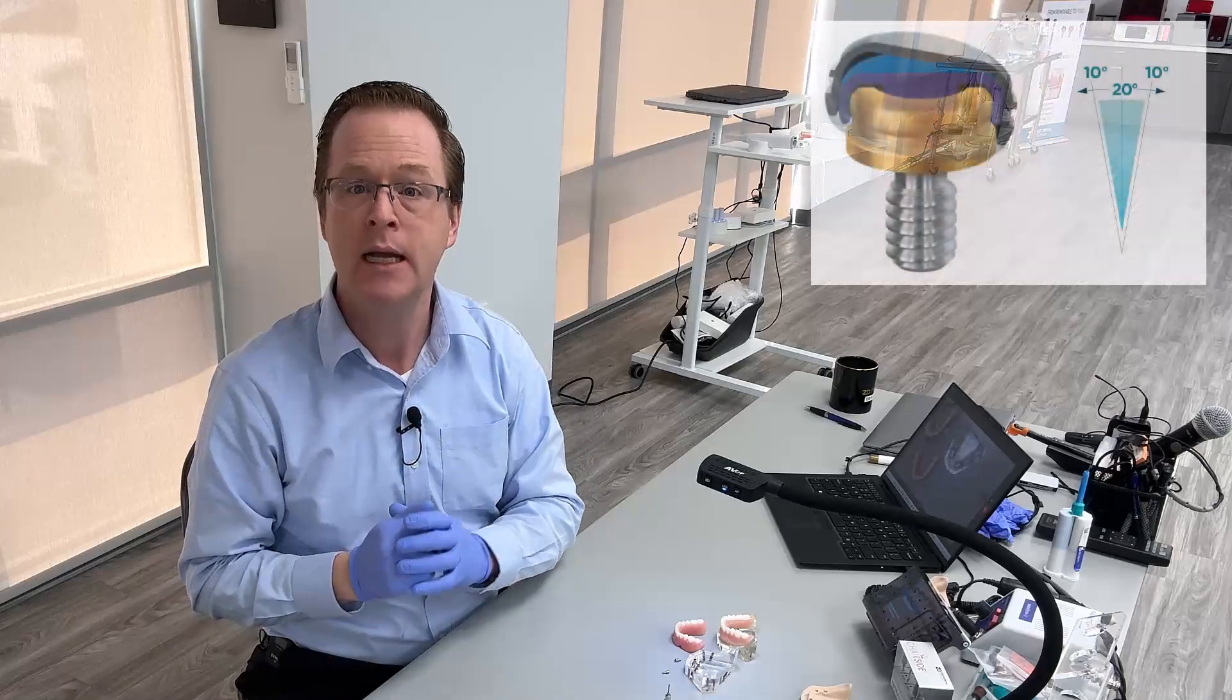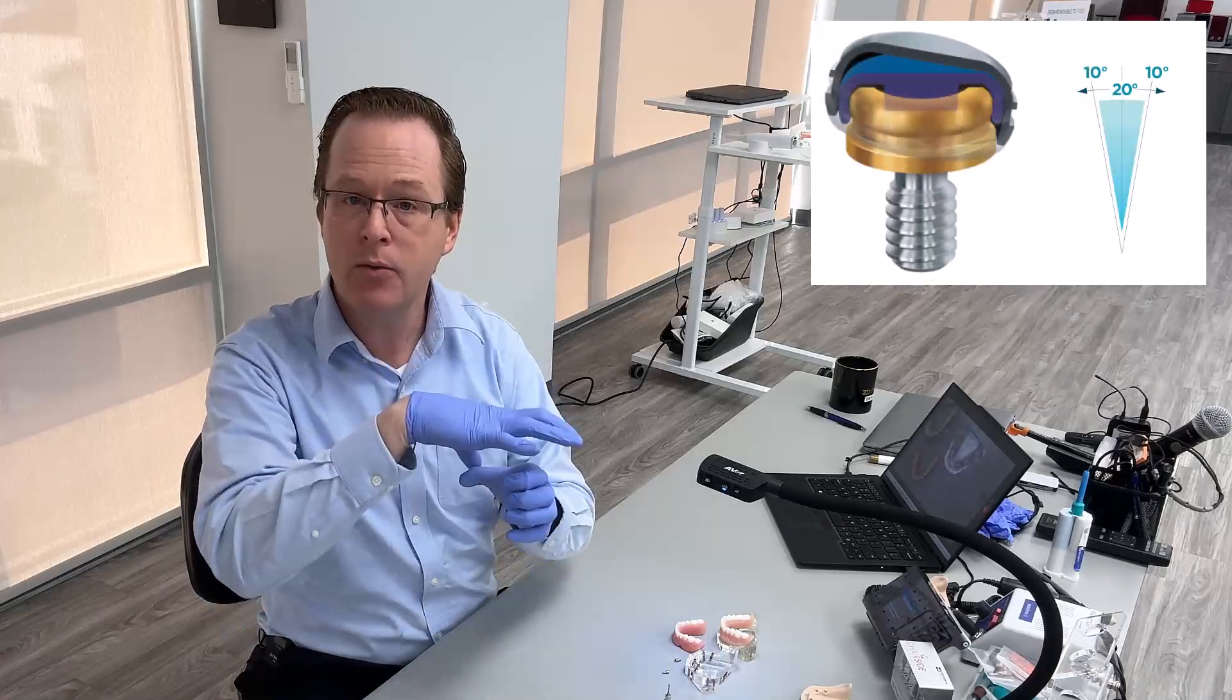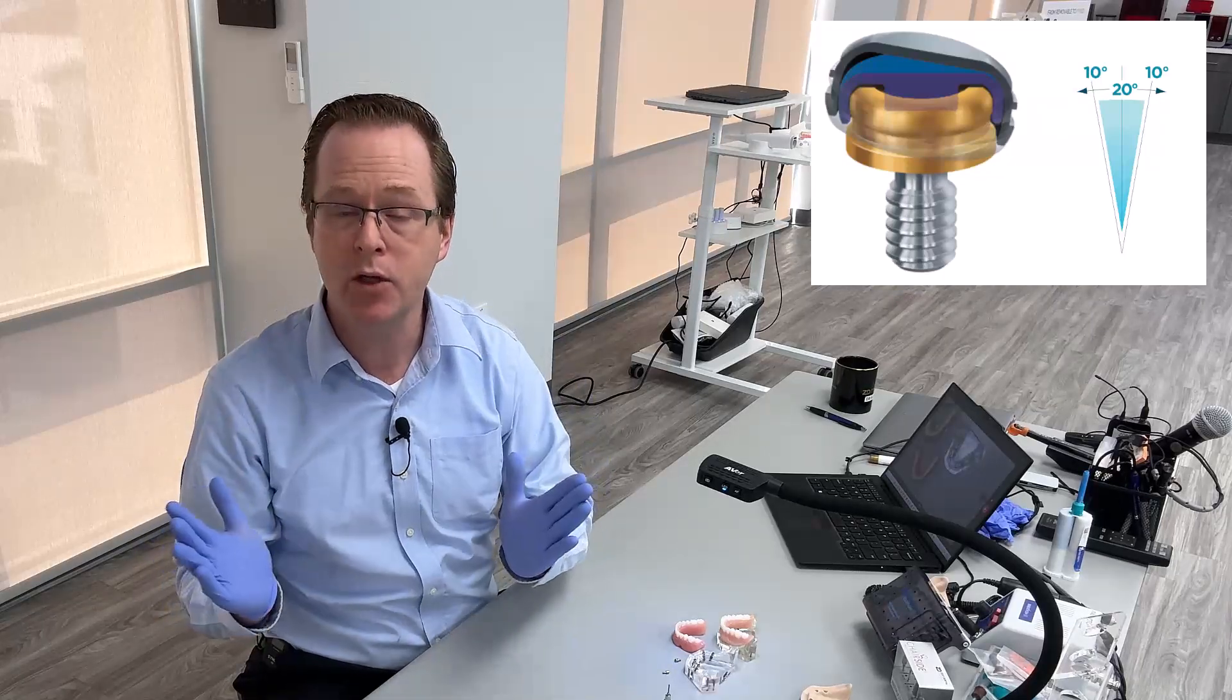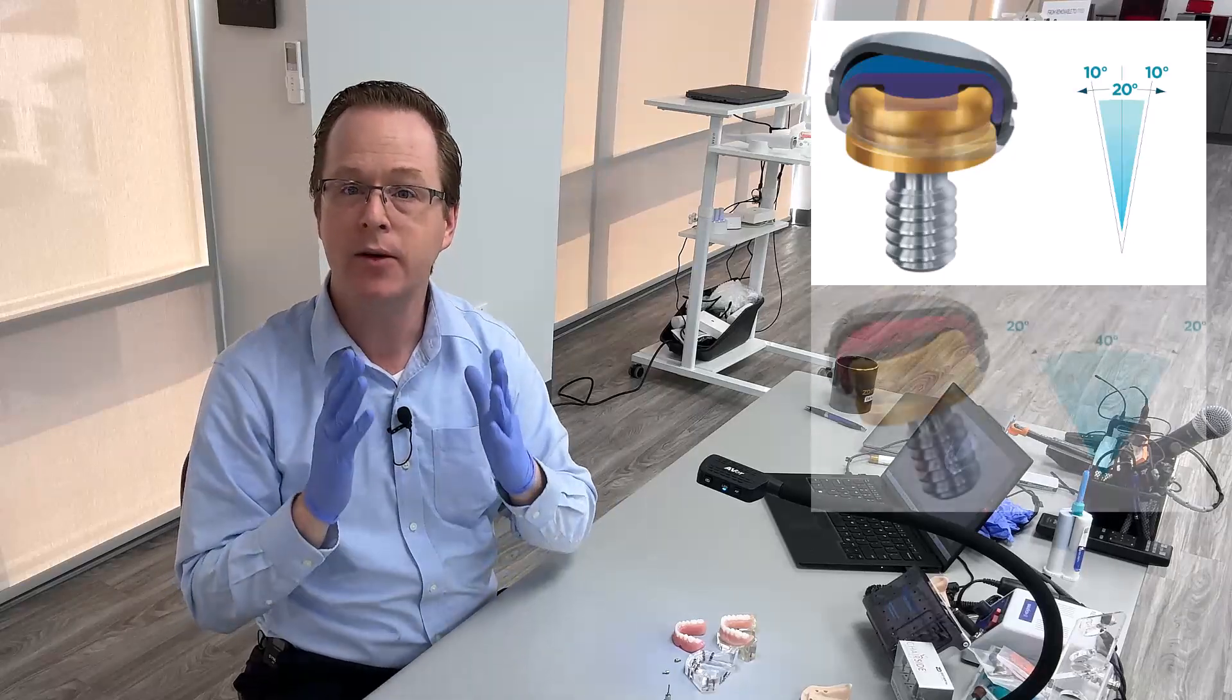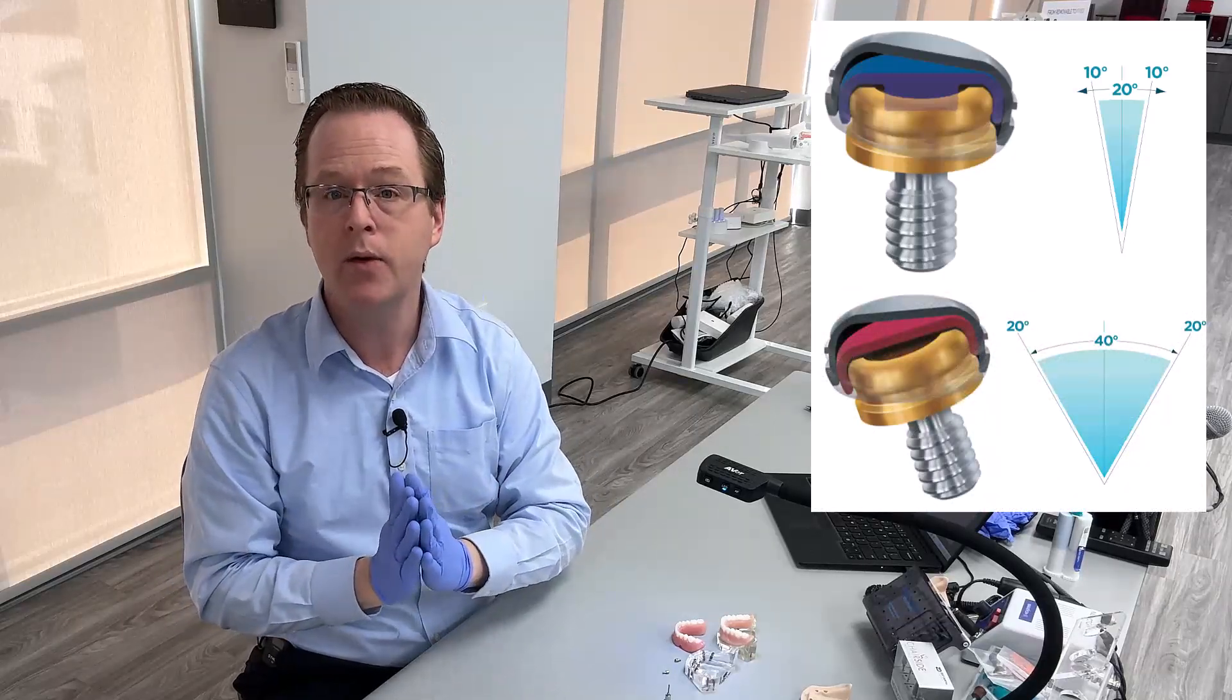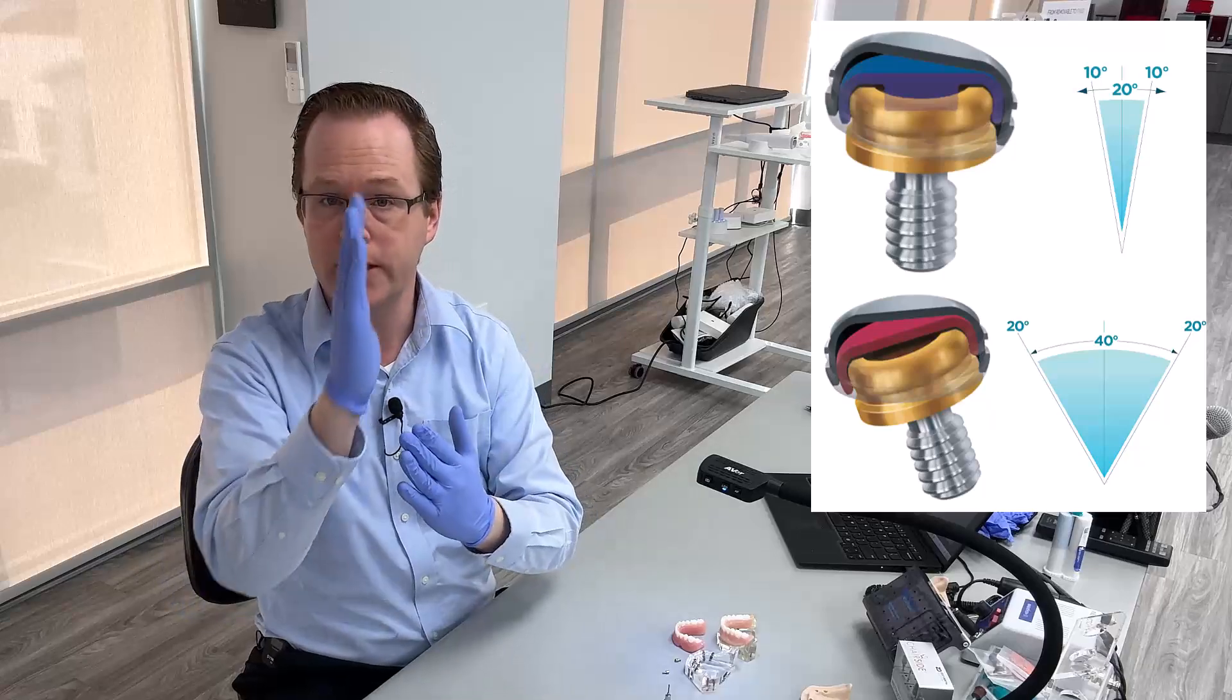Any angulation that you would have to compensate for your original locator, your non-angled locator, is done by the housing as well as the insert. So your standard range inserts you can correct up to 20 degrees of total angulation correction or 10 and 10 degrees between implants and your extended range inserts with the original locator, you can do up to a total of 40 degrees or 20 degrees between implants.